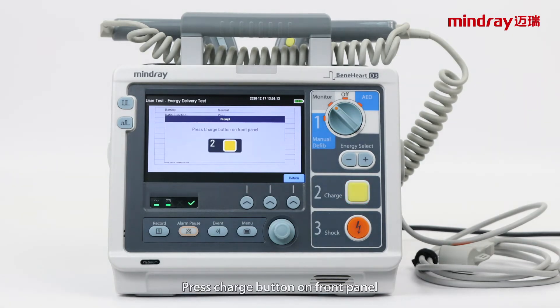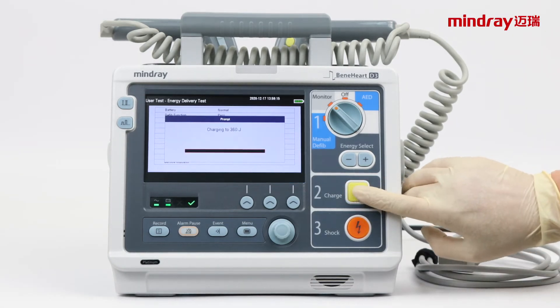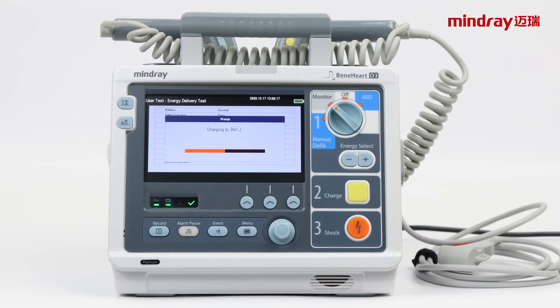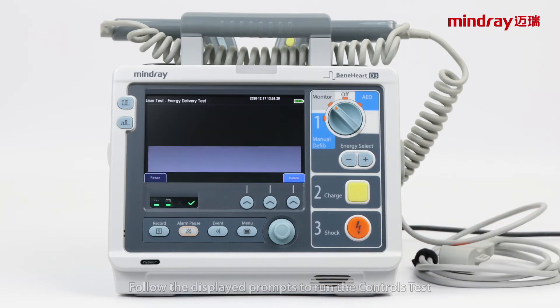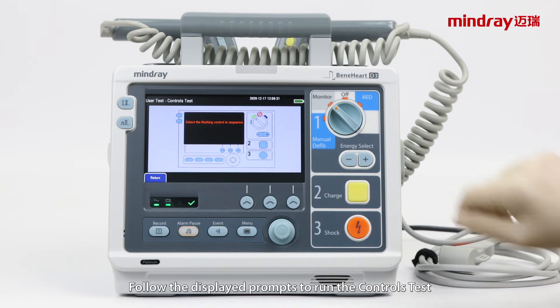Press the charge button on the paddles. Press the charge button on the front panel. Press the shock button on the front panel. Follow the displayed prompts to run the controls test.